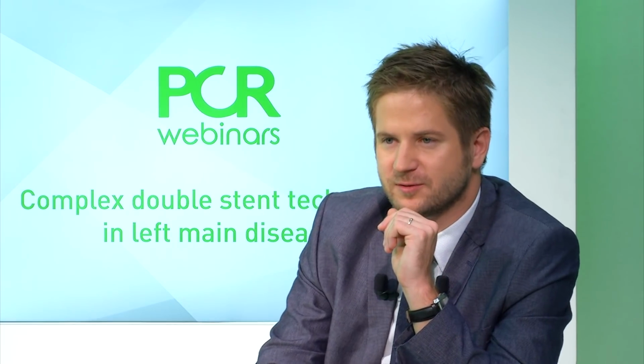So Chris, I believe that the positioning of the side branch stent is again the cornerstone of the whole T and protrusion technique. How can you be sure that you are positioned appropriately, or what are your steps or considerations during positioning?